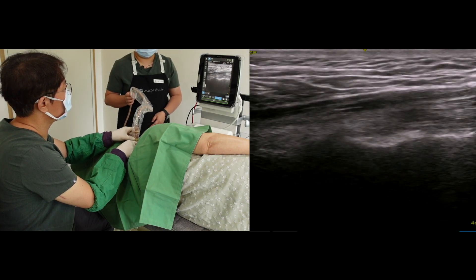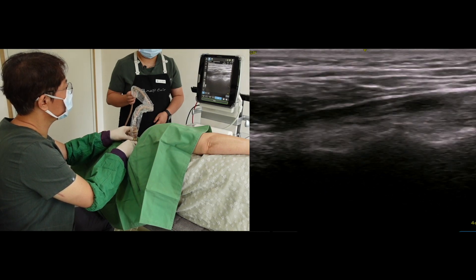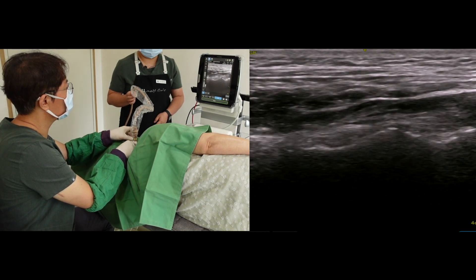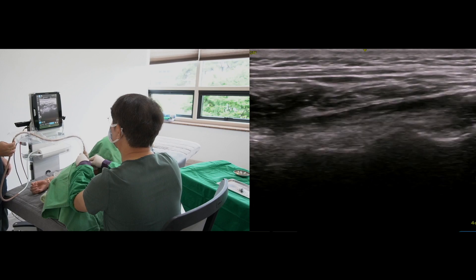Let me show you a longitudinal scan of the facet joints. Again, there are waveforms of the cortical surface and intermittent low-echo gaps. The periodic low-echo gap is the facet joint window.